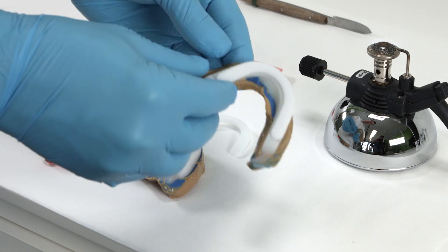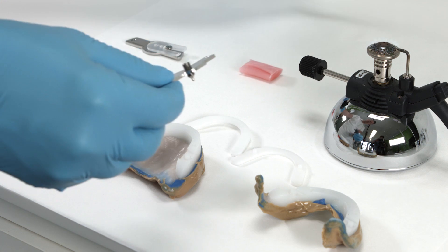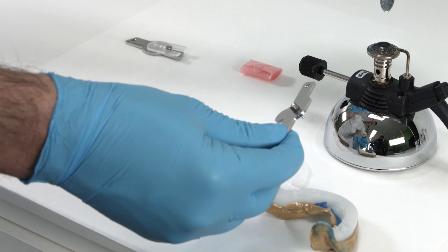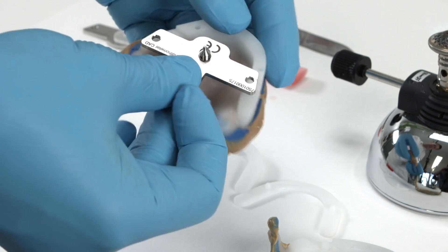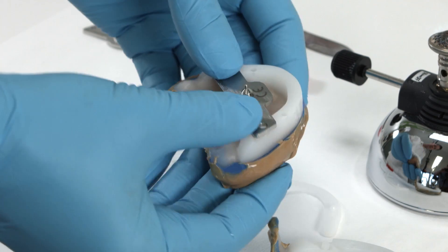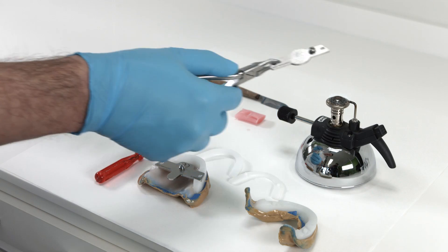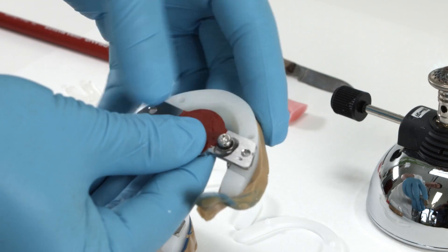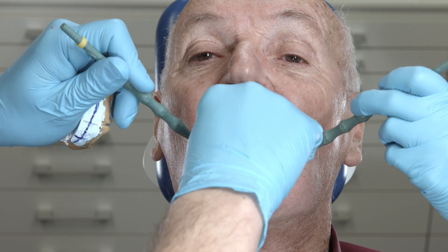Remove the white bite rims in preparation for the registration step. Use some wax to hold the adjusted screw in place. Attach the registration plate with a stylus to the upper jaw 3D bite plate by pressing it on the pre-cut retentive elements until it locks into place. Color the mandibular registration plate with a wax pen or permanent marker, and press the plate onto the 3D bite plate until it clicks into place.